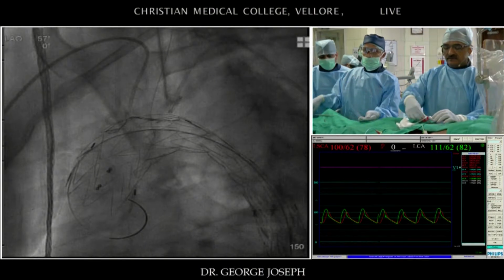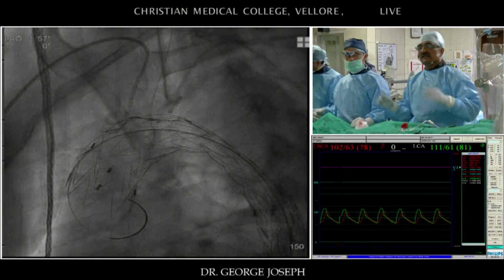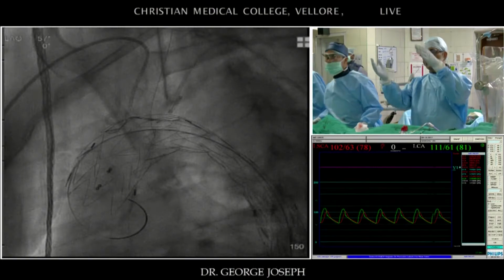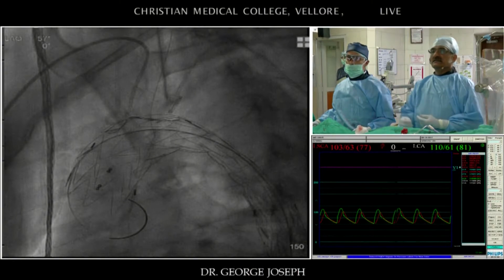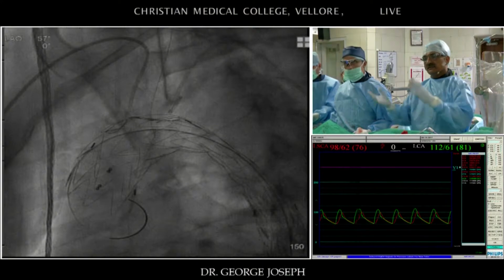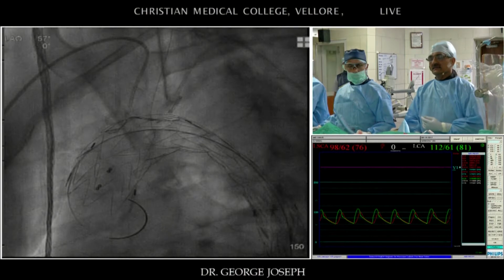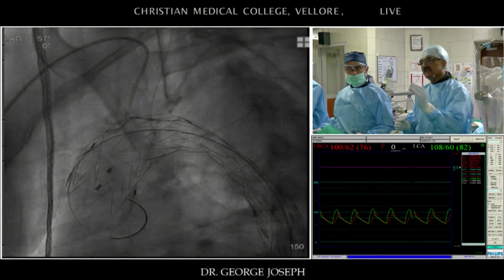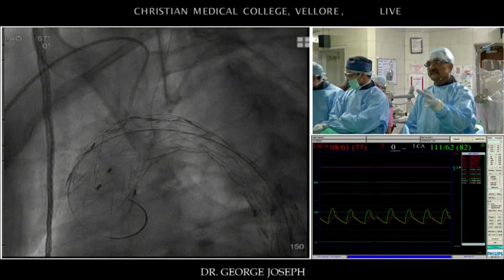Actually only 2 of them. We only cannulate the left carotid and the left subclavian, and the innominate I am just going to leave alone because I have got adequate seal beyond the innominate. The idea of starting in the ascending is that the ascending is straighter than the arch, and the graft has more stability when you start in the ascending, and the inner curve is very nicely covered. The fenestrations are all on the outer curve. So very often you get this bird beaking graft with an inner curve type 1 endoleak, which we don't get because we are starting in the ascending aorta.